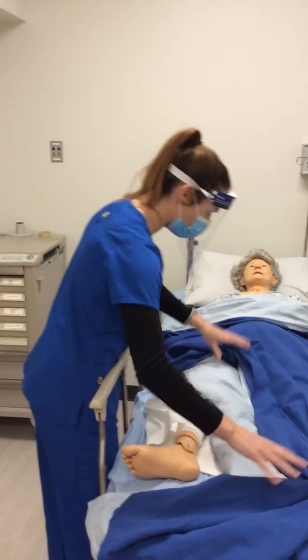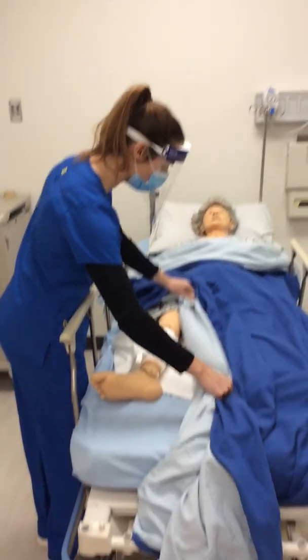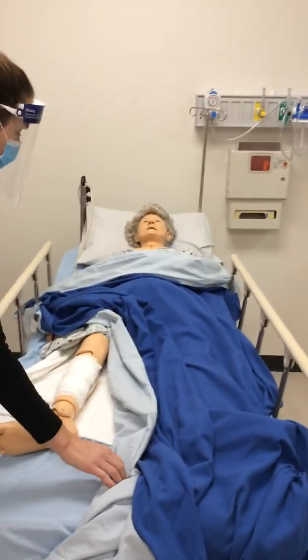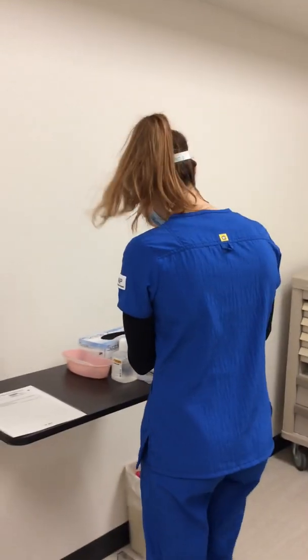Feeling pretty good after that pain medication? You're at a 2 now? Oh, good. No shadowing on this bandage. Perfect. I'm just gonna open up my wound cleaning kit and get the bio bag.